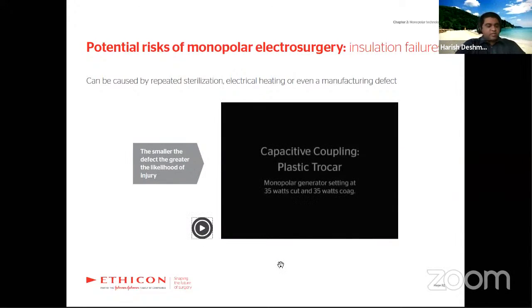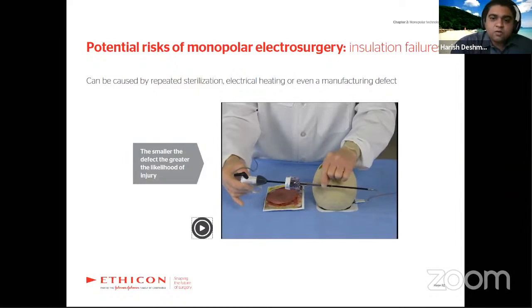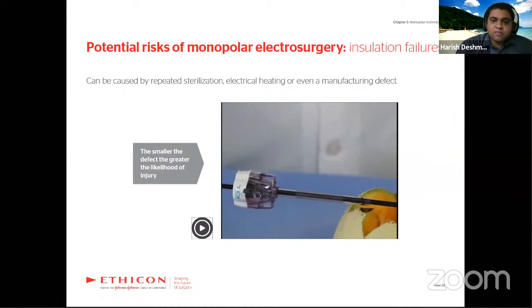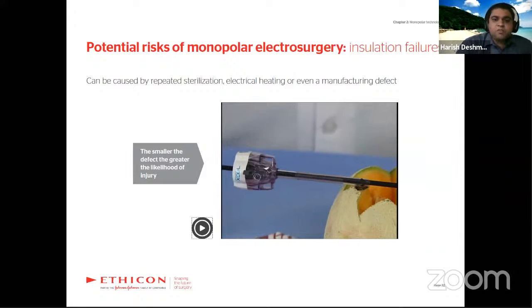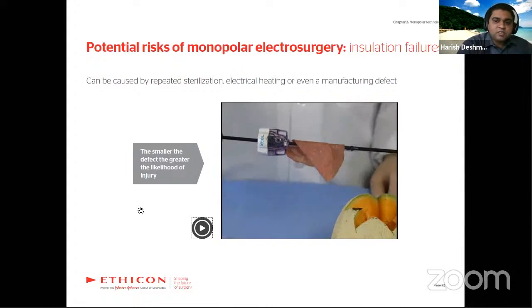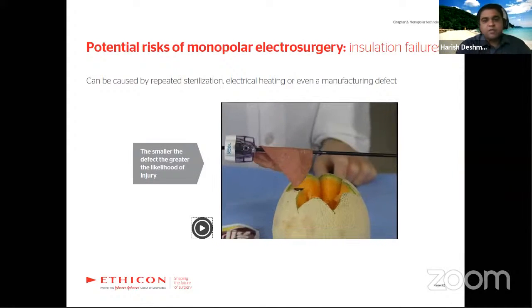Even with the instruments, whatever cautery pencils, monopolar hooks and other things we use during surgery are generally insulated. But when we are reusing them, if there is a slight issue with the insulation, there can be a spark coming from any portion of the device. So that insulation has to be maintained. We should always avoid any kind of current issue happening because of a manufacturing defect.